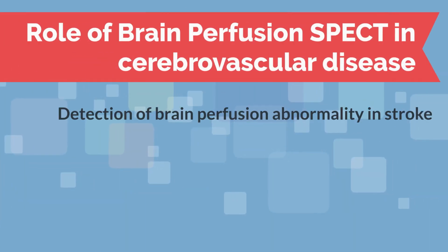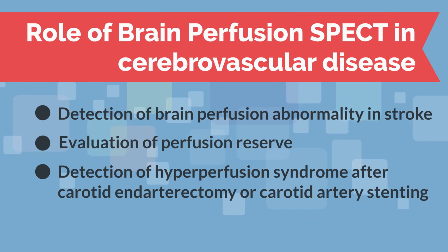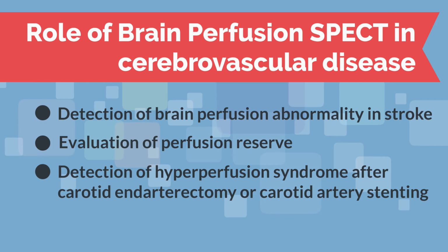The role of brain perfusion SPECT in cerebrovascular diseases is as follows. First, to detect brain perfusion abnormality in stroke. Second, to evaluate brain perfusion reserve. In addition, it detects hyperperfusion syndrome after carotid endarterectomy or carotid stenting.